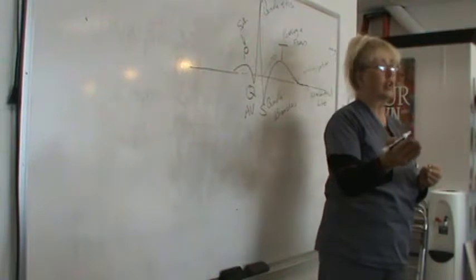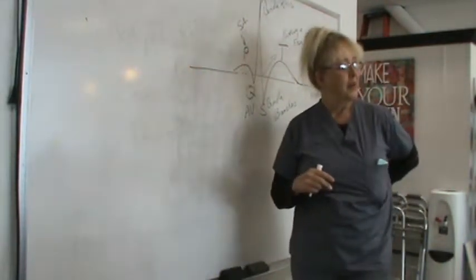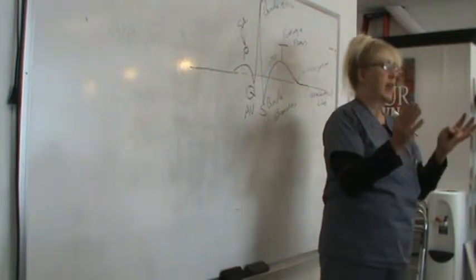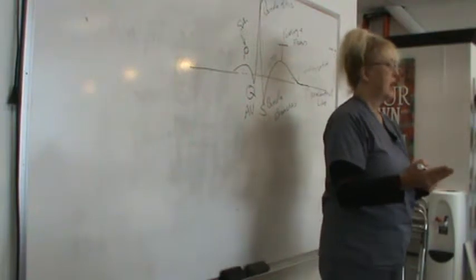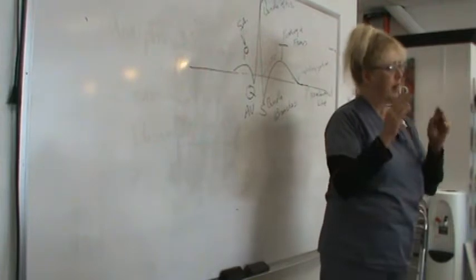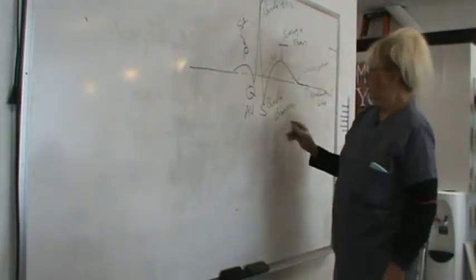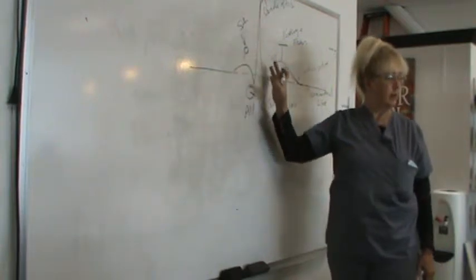And if we wanted to look at the heart posteriorly, we'd actually have to put leads in the back. But we're not doing that. Basically, we're looking at the full frontal part of the heart, the anterior and the lateral parts of the heart. So it's kind of hard to diagnose a posterior MI without actual posterior lead placements in the back. But you're not going to be doing that, okay? So this is basically how we look at a heart rhythm.